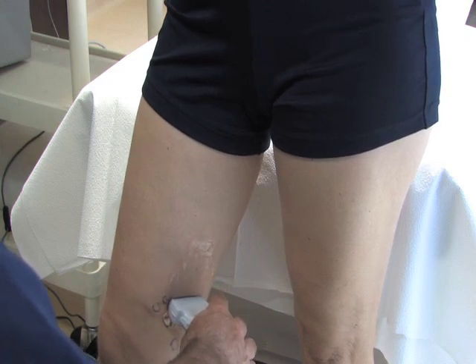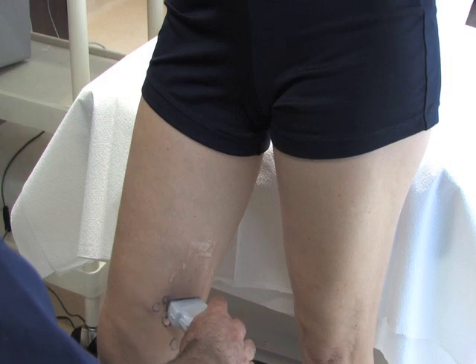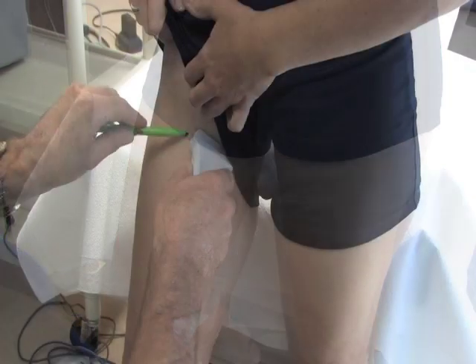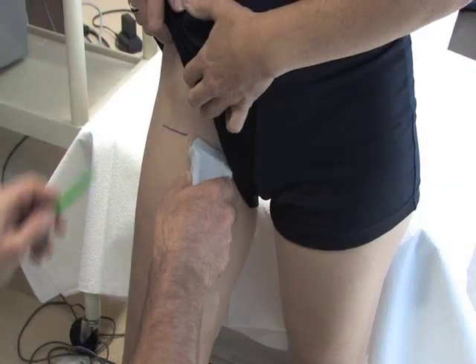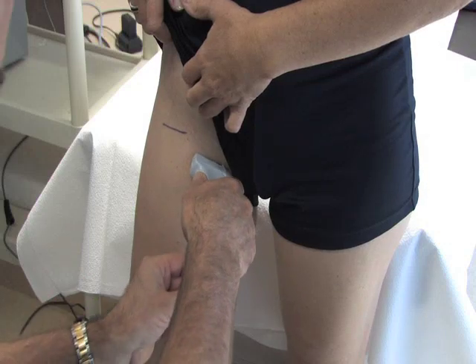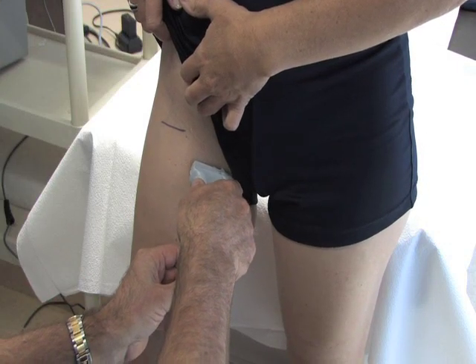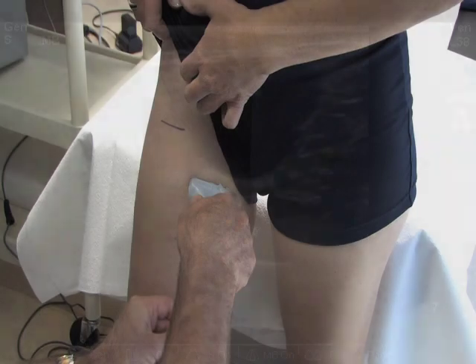use a linear transducer to scan the entire greater saphenous vein. Start at the sapheno-femoral junction, or SFJ, with the transducer oriented in a transverse plane.